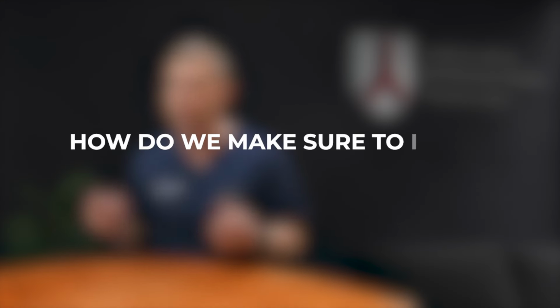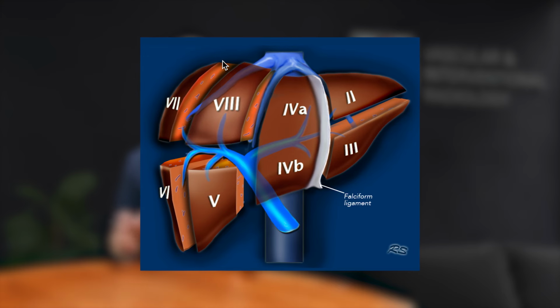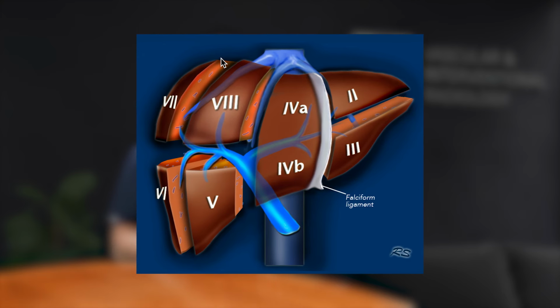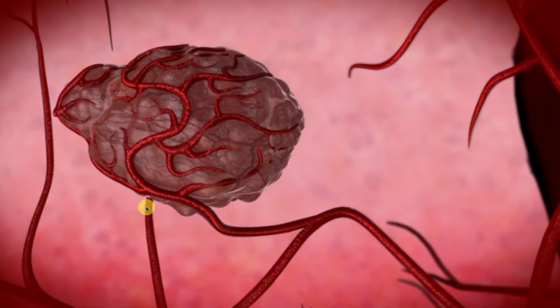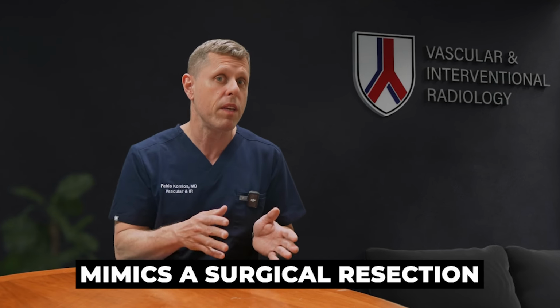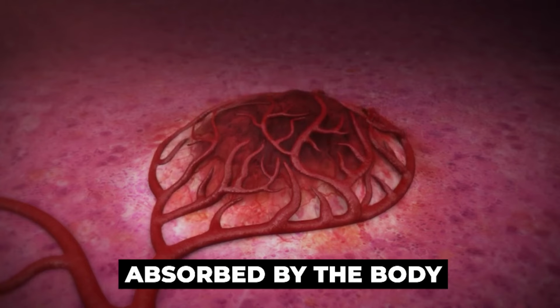So how do we make sure to spare most of the liver while treating the tumor? You see, the liver is divided into 8 segments. Each segment is supplied by its own artery. With Y90 segmentectomy, we can isolate a segment with cancer and just inject enough radiation to destroy it. Essentially, it mimics a surgical resection, but without an incision. And you will see, over time, the treated segment will shrink and will be absorbed by the body, just like if it was surgically removed.